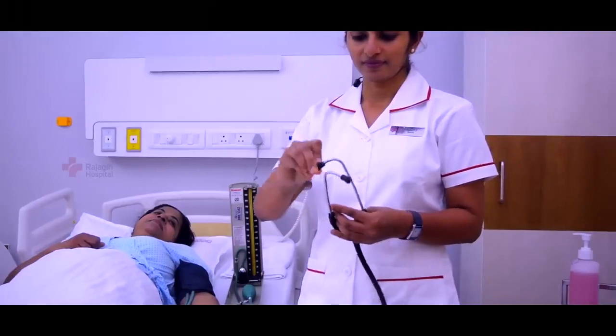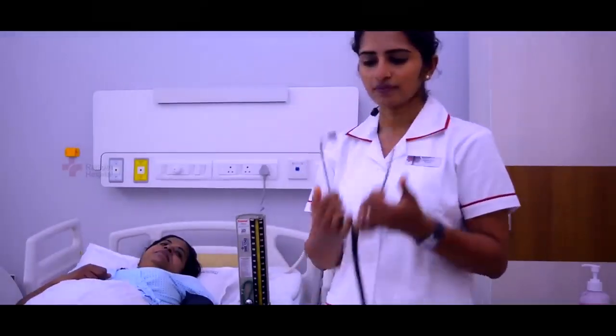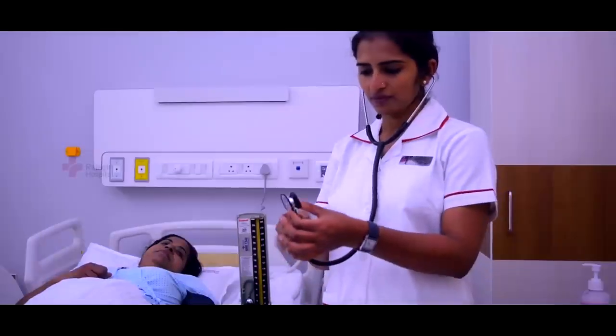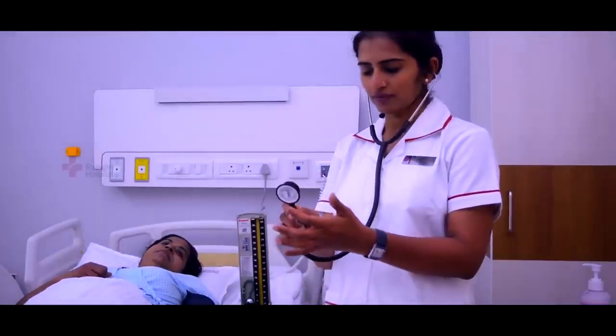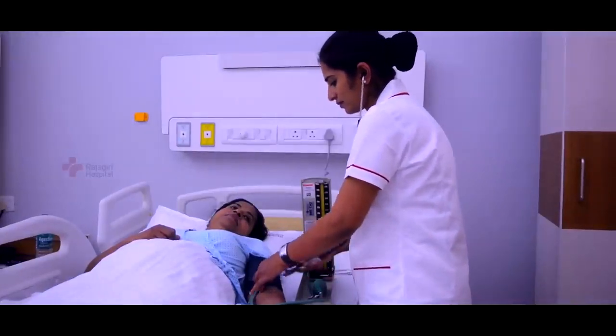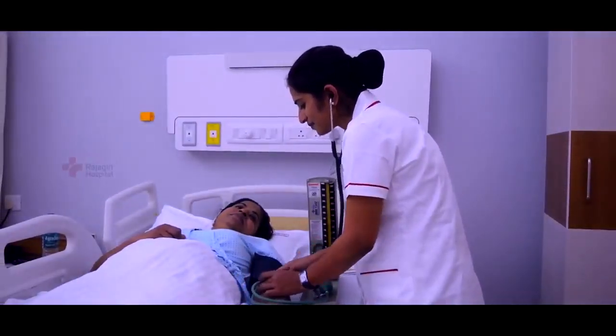Clean the stethoscope with alcohol swab. Proper positioning of the stethoscope earpiece in the ear. Check the diaphragm of the stethoscope. Palpate the brachial artery with 3 fingers. Place the bell of the stethoscope over the brachial pulse.